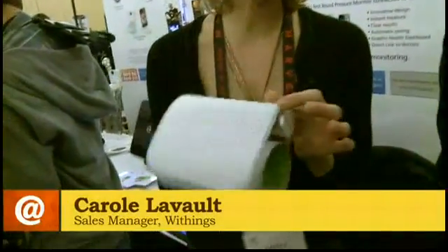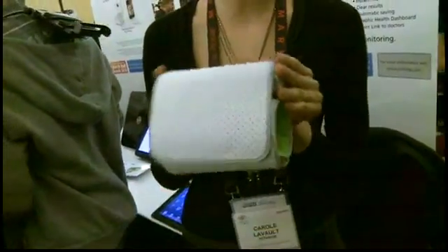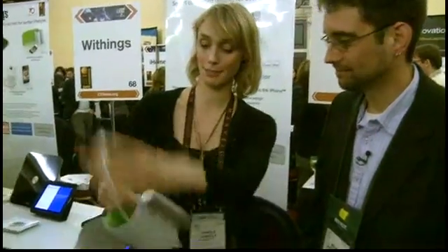Here with Carol from Withings, and we've got a little device here all wrapped up. It's simply a blood pressure monitor that is compatible with the iPhone, iPod, and iPad. You just need to put it on your arm.